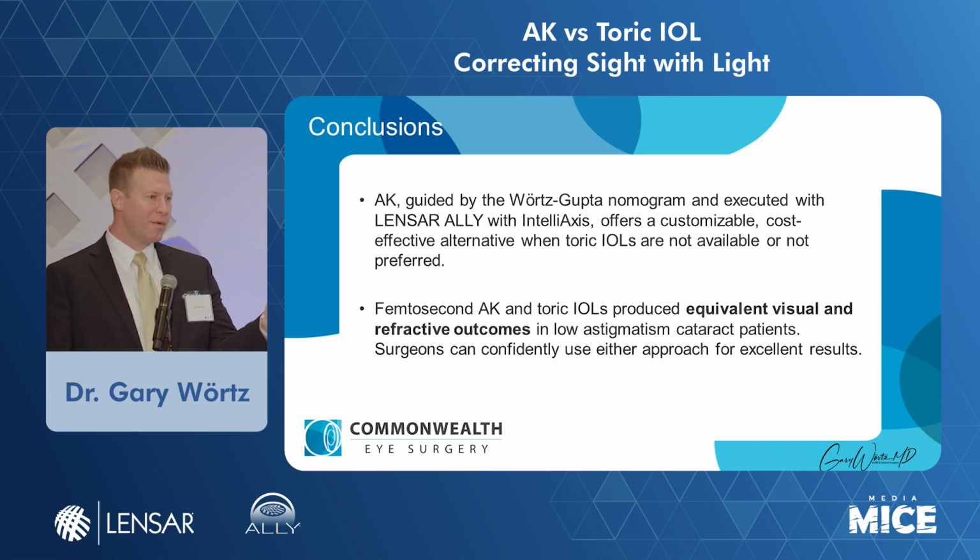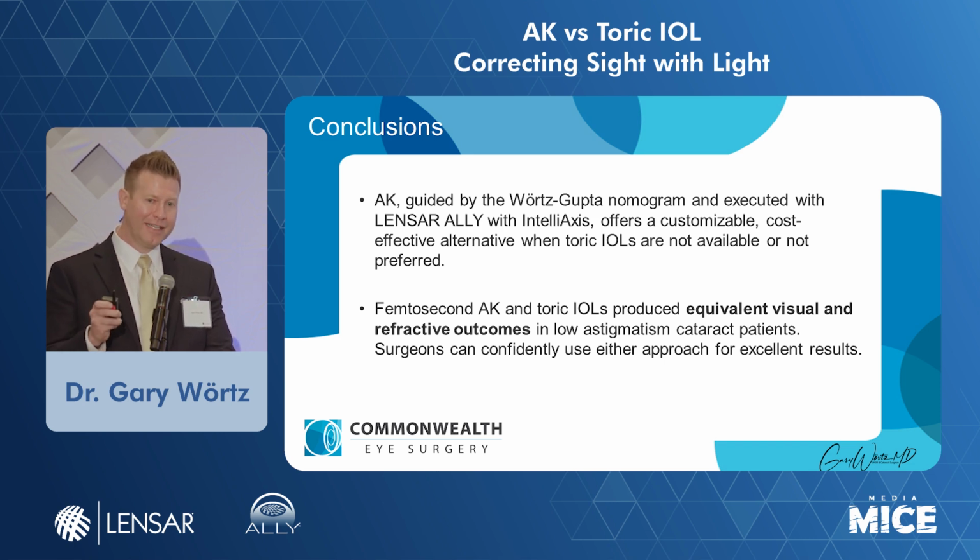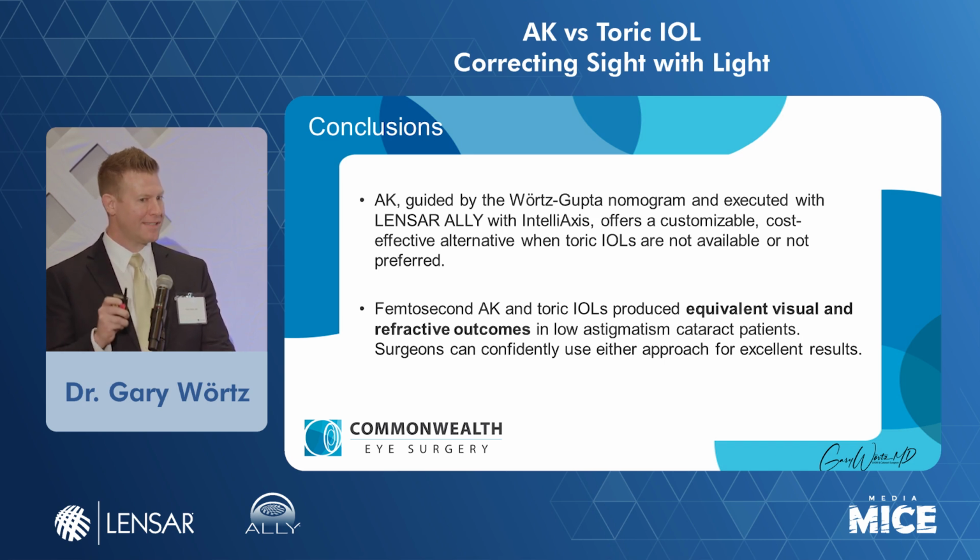But the conclusions that we came to really is that AKs, when you're using a modern formula, I've got a little interest in this, it's the Wőrtz formula, with the LENSAR Ally with IntelliAxis. And that's a really important thing as well. You've got to make sure you're putting the arcs on the intended axis. And if you're putting a toric in, you want to make sure you're using image guidance with those tabs. I think that might be what is making this study shine maybe a little bit more than other studies is we're using the best technology. We're injecting that data into the laser. We're putting the toric where it should be. We're putting the AKs where we want.